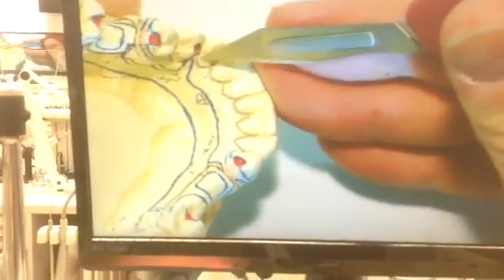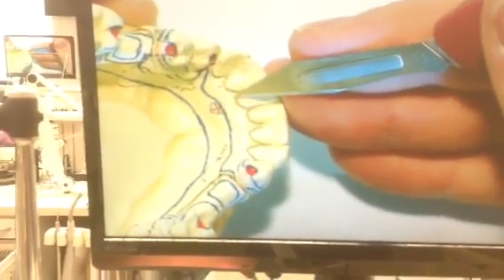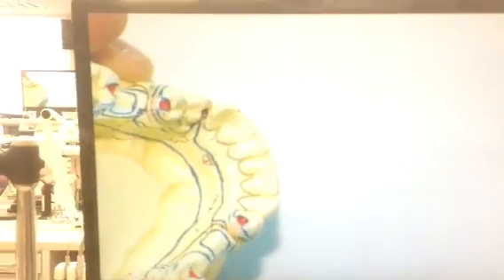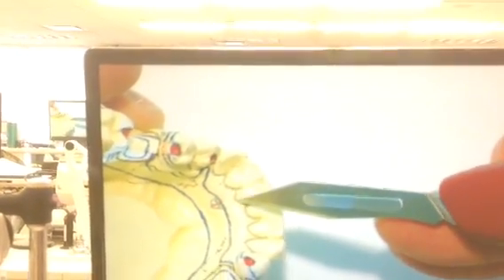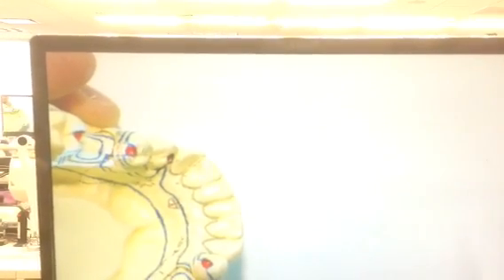It's always going to be down here on these caps. It's always going to be down here at the tissue. So I know you're going to be above it. You know you're going to be above it. But we need to mark the pencil line to show that you did think about the height of contour and demonstrate that you knew you were above that height of contour. And scallop the edge, and you'll be fine.